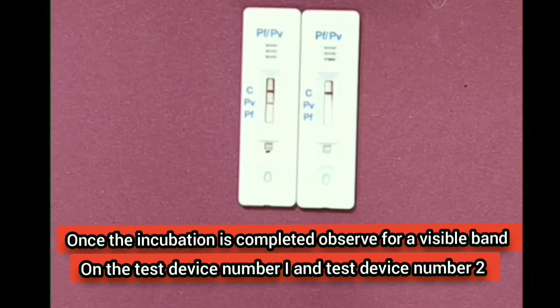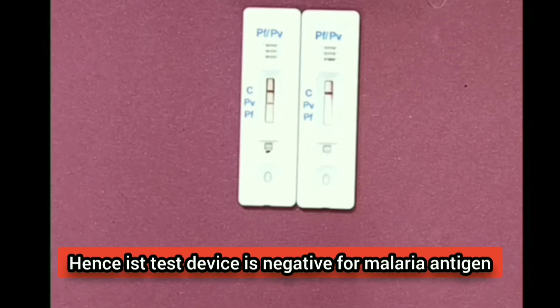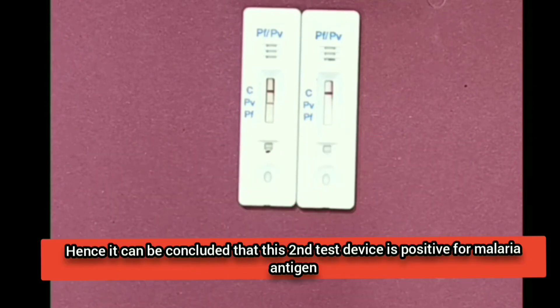Once the incubation is completed, observe for a visible band on test device number one and test device number two. In the first test device, there is a band in the control region only — there is no band in the Plasmodium vivax or Plasmodium falciparum regions, so the first test device is negative for malaria antigen. In the second test device, there is a band in the control region and also a band in the Plasmodium vivax region.